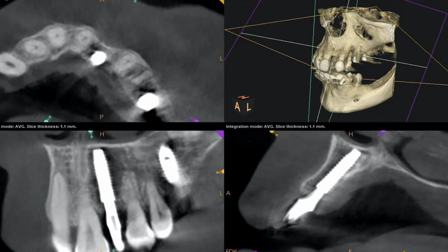And so as part of the review of this live surgery that you just saw, looking at now a three-dimensional x-ray, we get a look at it and just make some decisions of what went well and what didn't go well as we reflect through the surgery. As far as implant placement is concerned, I'm really happy with it. You can see on the bottom right, we have really ample buccal plate. We have good lingual plate.